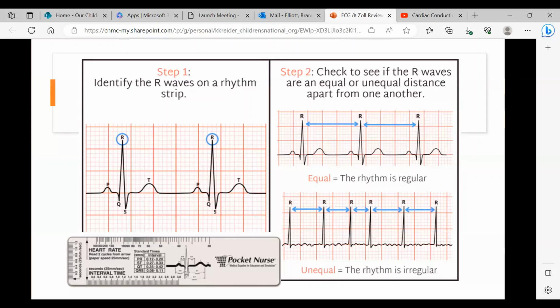Once we determine if it's regular or irregular, we can go from there to the other parts: how wide the QRS complex is, whether it's narrow or wide, and making sure we have the ST segment at the end as well. So just to get down a few basic practices of looking at an ECG rhythm, we're going to look at whether the rate is regular or irregular, and determine the rate, and based on those two things, we're going to see if we can identify the rhythm.